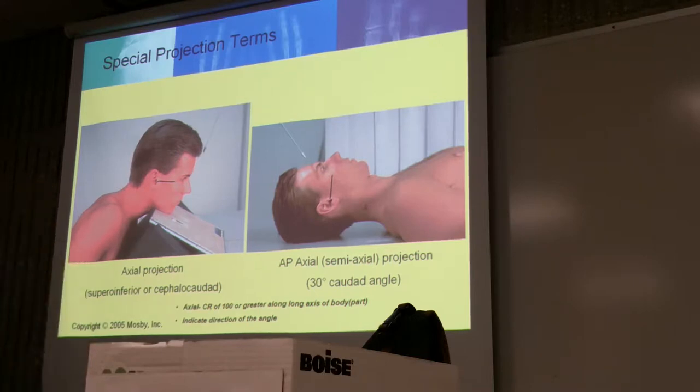And then the direction. I'm going to throw some new words at you now. We're not talking about the X-ray angle being perpendicular or horizontal. We're talking about angulations in between this and this. So we need to determine which way the X-ray beam is being directed. Two key points: it's either pointing towards the top of your body or towards the bottom of your body.